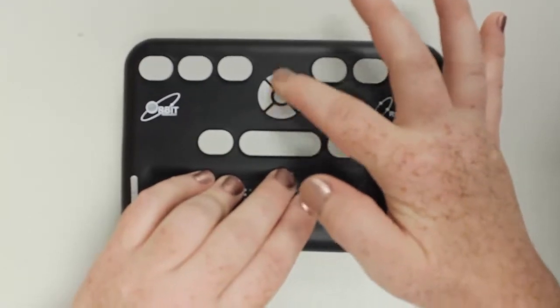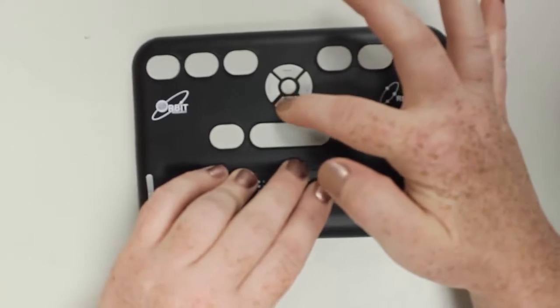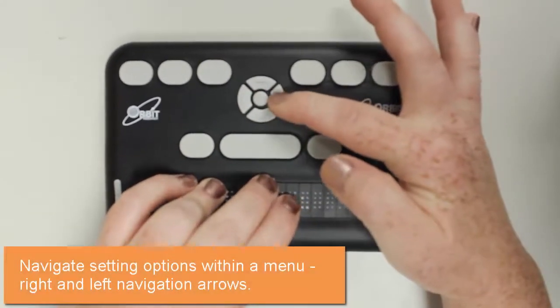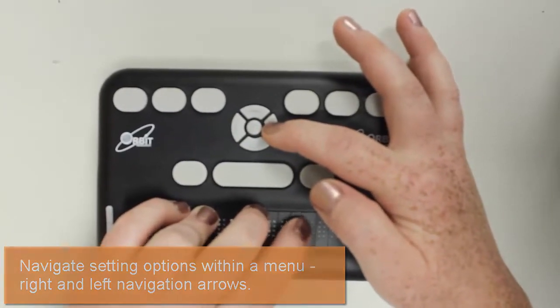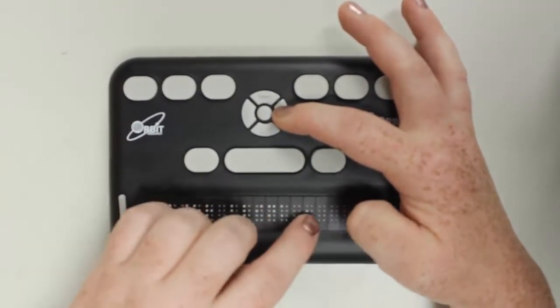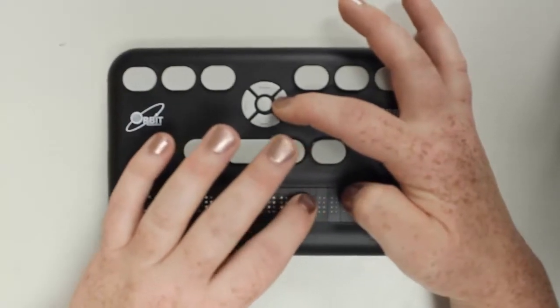You can change that blink rate. Remember how we used our up and down arrow keys to move among the menu choices? For the menu options, you use your right and left navigation arrows. If I want to change this to a different blink rate, I can use my right arrow. And now it says five. You'll see that there's not a dot seven and eight underlining that five now.